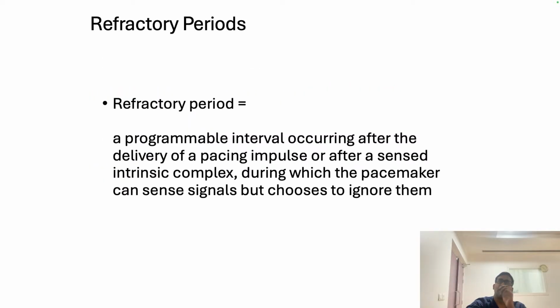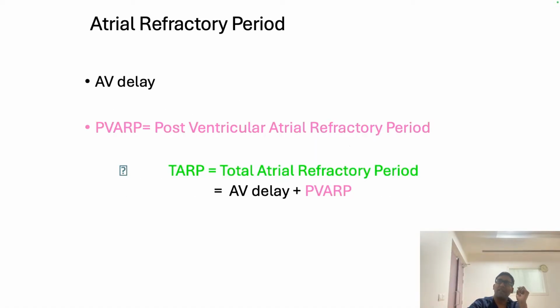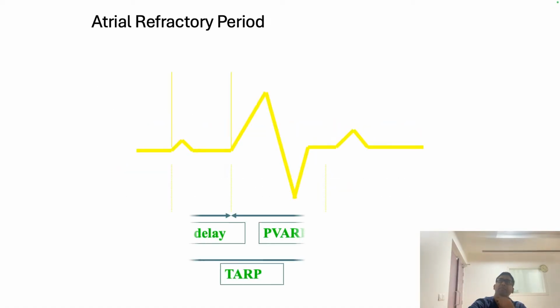If the patient has atrial fibrillation, it will convert to DDI mode, because the atrial rate is very high and we don't want to track it to the ventricle. So a patient with a DDD pacemaker will convert to DDI. That functional part converts automatically, depending upon the condition.